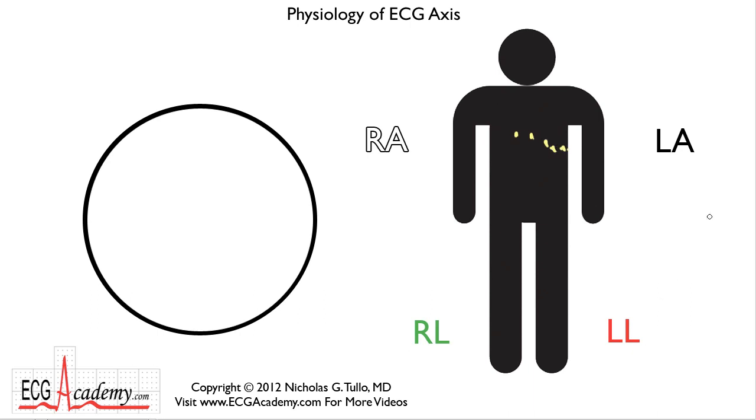Now, as far as the color coding is concerned, I had reminded you that if you're driving in the United States and your left arm is hanging out the window, it'll get tanned. So that reminds you that the left arm gets the black electrode. The right arm will not be tanned, and so that gets white. Your right leg is over the gas pedal, so you get green for go, and the left leg would be over the brake pedal, and red would be for stop.